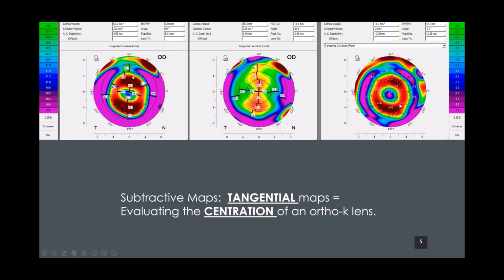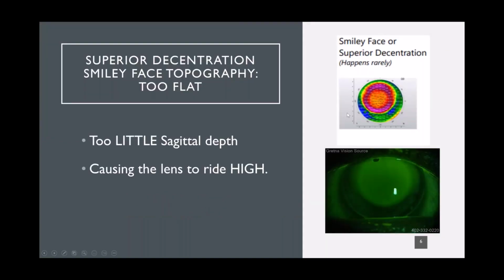A general belief is that for good myopia management, you need at least a portion of that red ring to be within your pupillary margins in order to stimulate that peripheral myopic defocus and those aberrations that cause that stop signal for axial elongation. All right, so we'll move on to the next slide here.